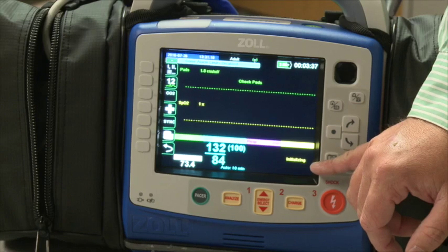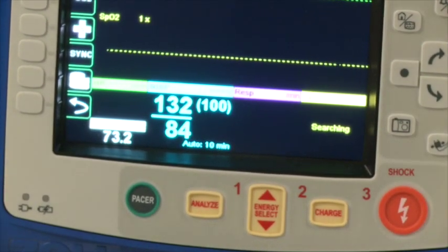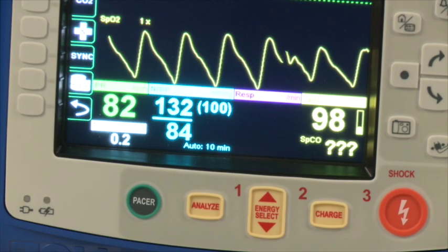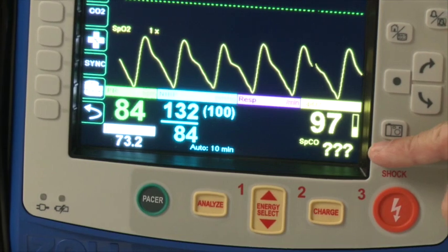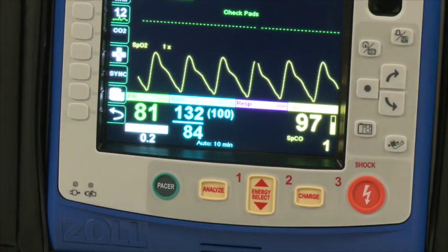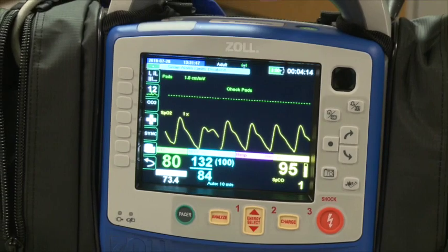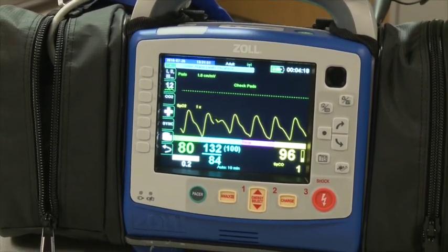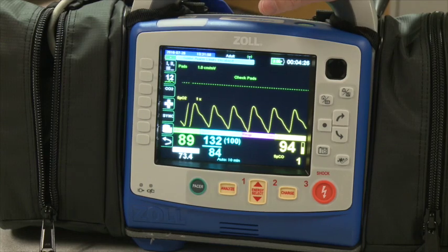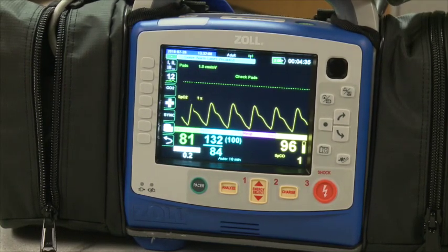After the SpO2 reading displays, about five to ten seconds later there will be a CO reading — carbon monoxide, not end-tidal CO2. Think of it as measuring poisoning from carbon monoxide exposure. Most people run with a little CO in their system — a zero or one is normal. As a general rule, if they get into the double digits and are not a heavy smoker, that is something to note. You can also configure an alarm to alert you any time the reading is over ten, so you don't have to look for the number every time. Every time you put the probe on a patient's finger, it will automatically display the SpCO reading.